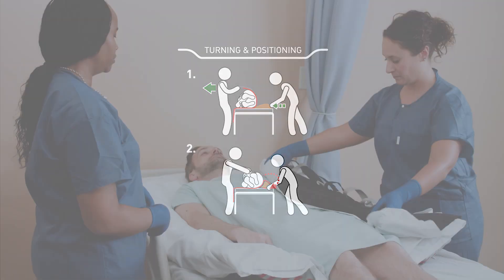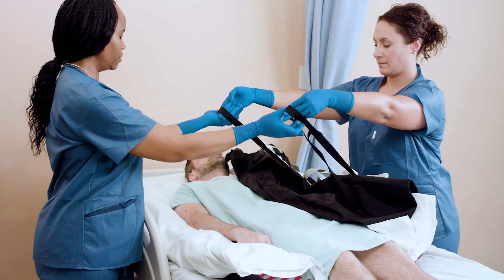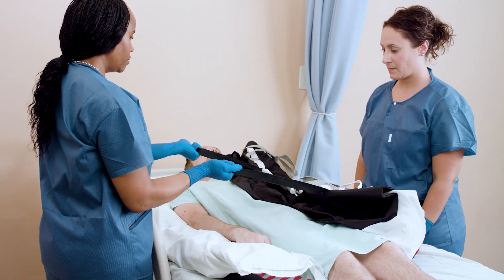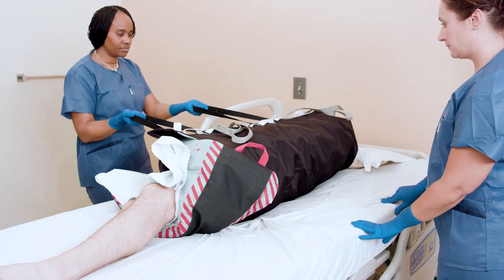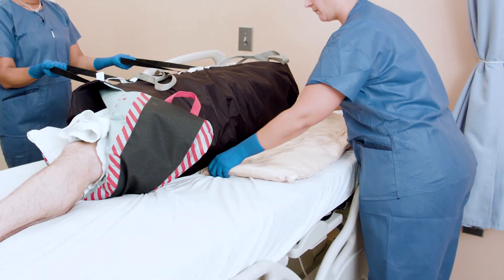Turning and Positioning: To start turning a patient, reach across the patient and grasp two of the black or gray straps. Don't pull with your back, but instead keep it straight and your elbows close to your body. Take a few steps back, using your legs to turn the patient towards you.